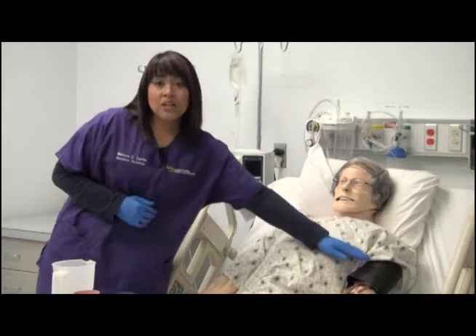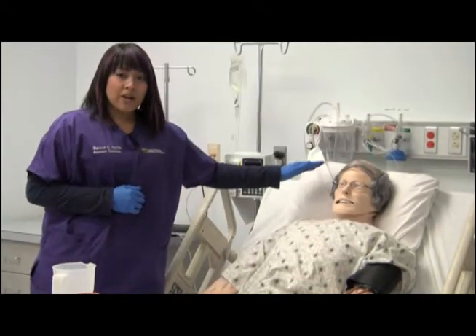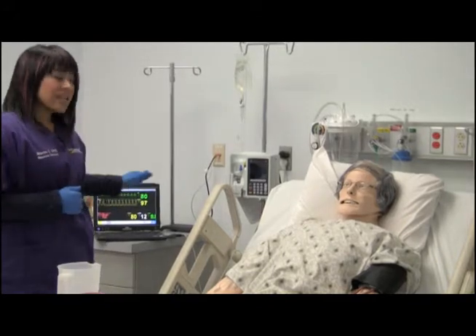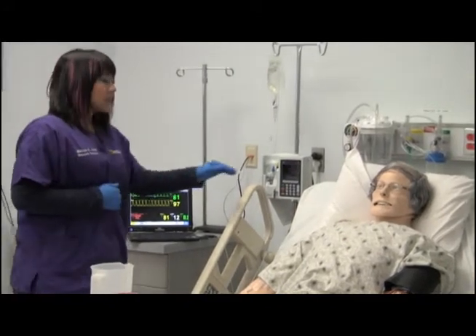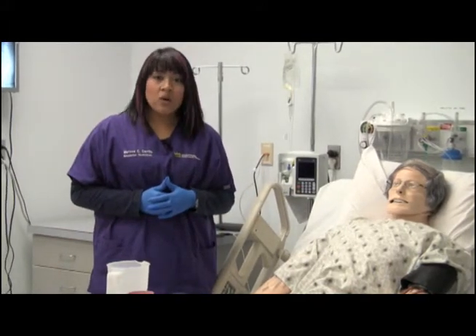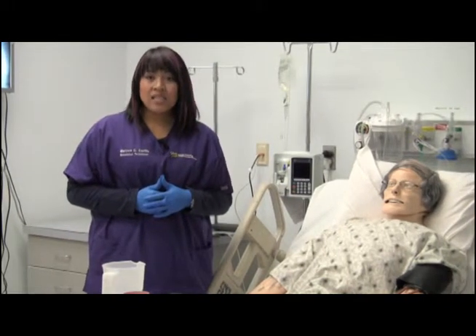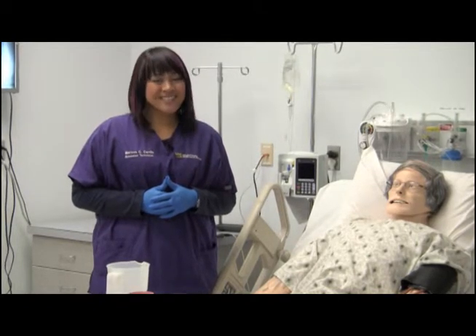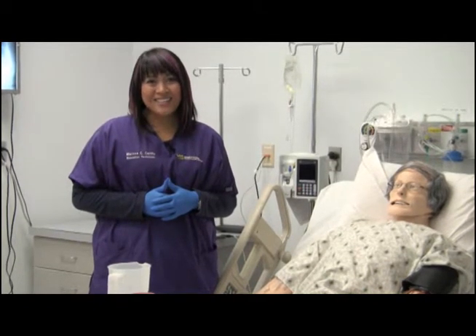You can also monitor his blood pressure, pupillary responses, practice airway occlusion and intubation, monitor ECG, cyanosis, and seizing. SimMan 3G also has the ability to cry, sweat, froth at the mouth, and urinate. And communicate as well.